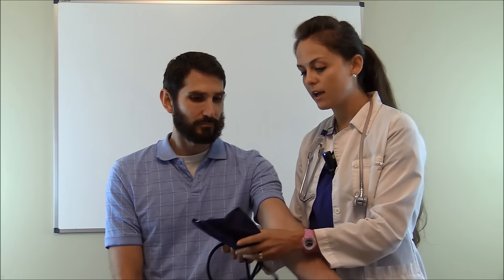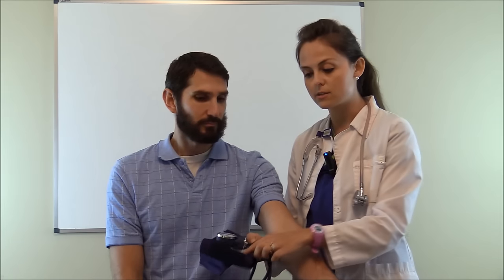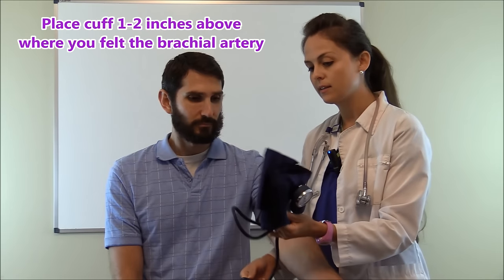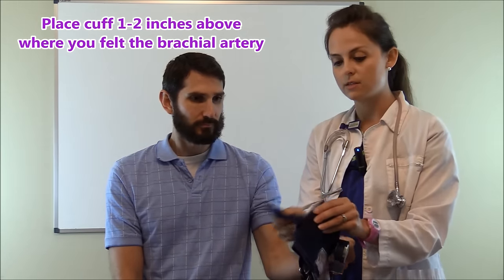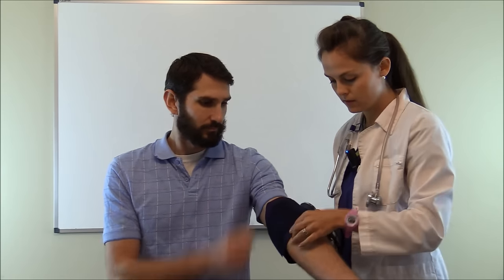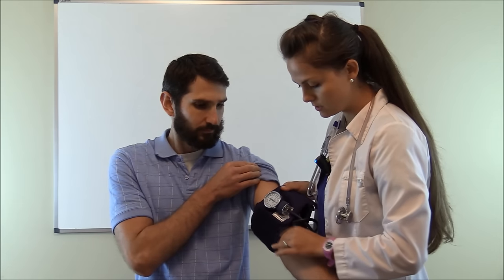We feel about right here because on your blood pressure cuff you have these little arrows and it says left arm right arm. This is his left arm so we're going to make sure that we put this arrow about one to two inches above that artery. So let's slide it up and make sure our cuff fits properly so we're putting that arrow about one to two inches above where I felt the brachial artery.